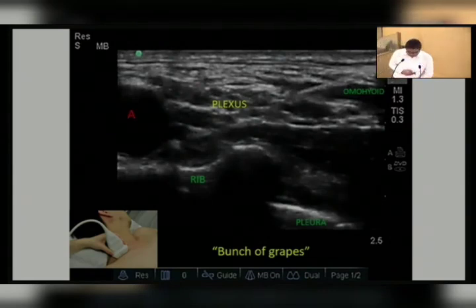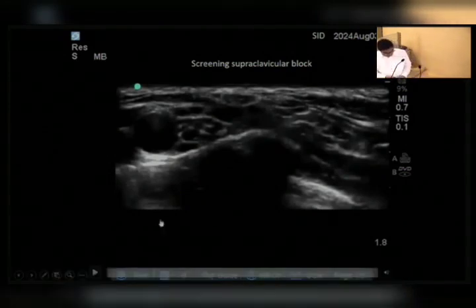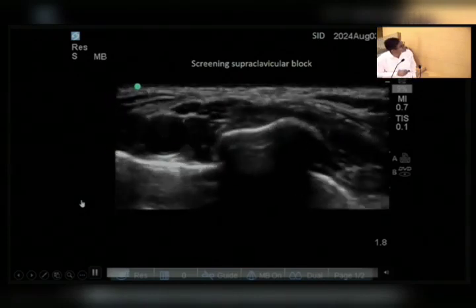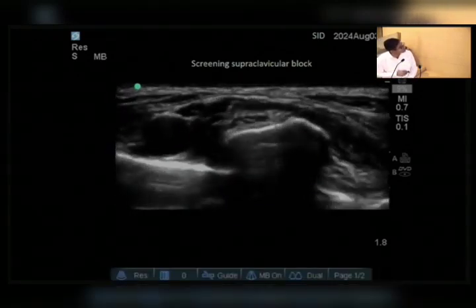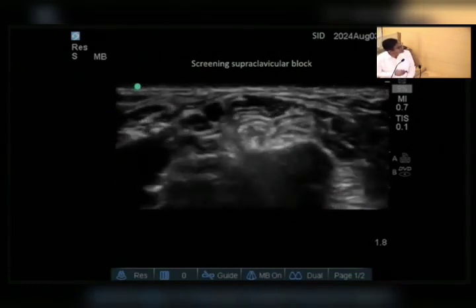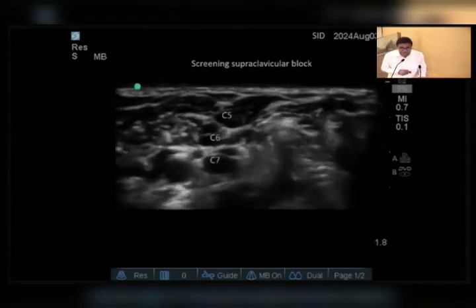So let's see some actual block. In that, the needle will, this is scanning. So here we will find the subclavian artery resting on this first rib, and we try to identify this area, that is the lower trunk, which is formed by C8 and T1.